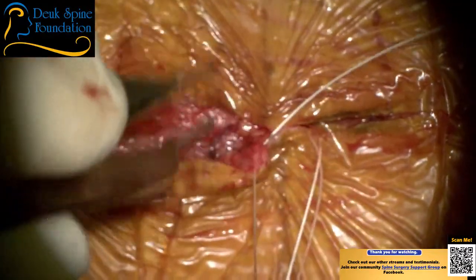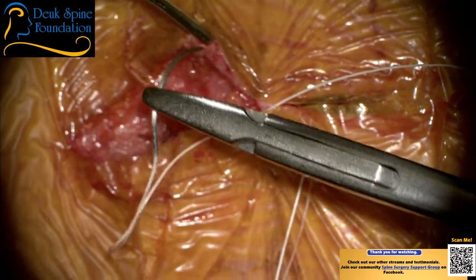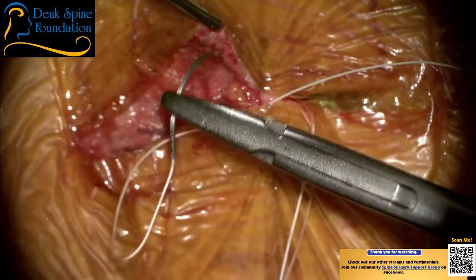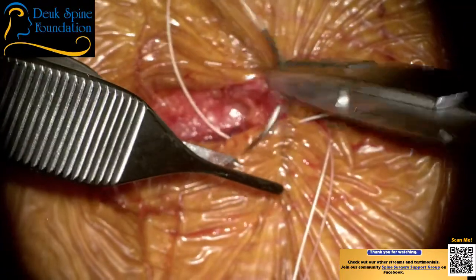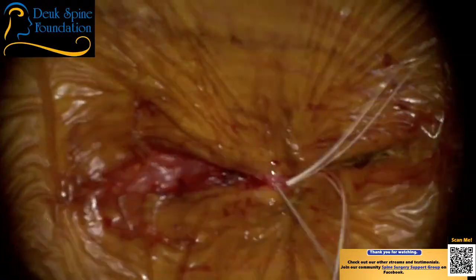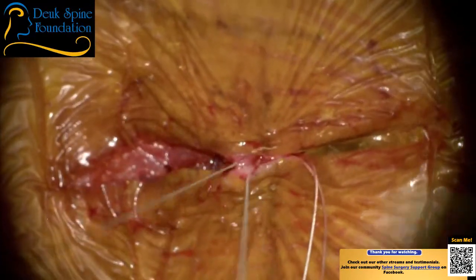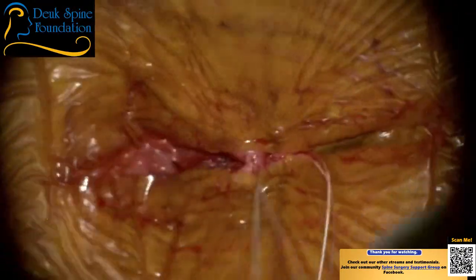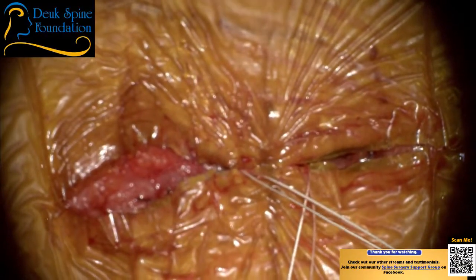The ones that come in a pack are usually designed to be used as multiples. Does that make sense? Do these come in a pack or as singles? These come as singles. These are cutters, right? Yes, but they are really aggressive cutters. I like to close this with interrupted sutures, meaning multiple sutures, not the runners. So that's your pack of sutures. You understand?